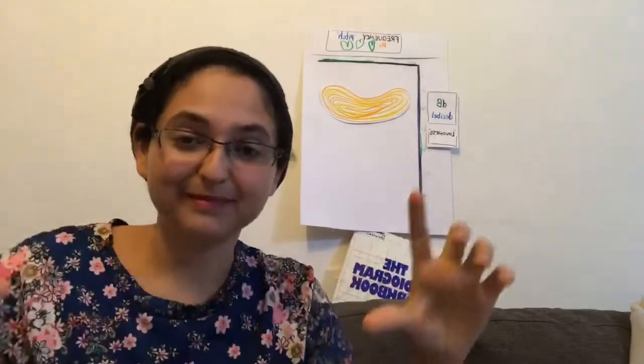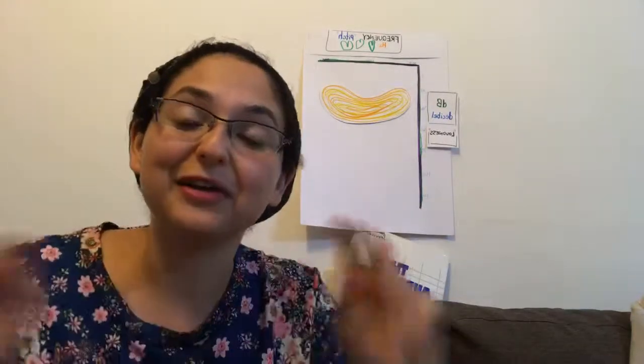And if you don't have this, then you can ask your audiologist to put your child's audiogram over a speech banana, or you can do this on your own just by Googling a speech banana audiogram, and that will come right up for you with the exact numbers. Great question.